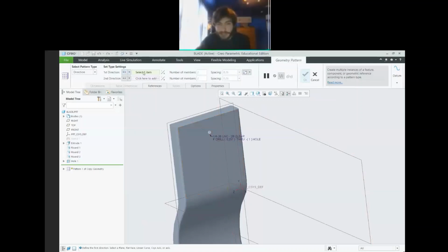So the first thing it wants us to do is to select our direction. And so we will select this, any sort of vertical line will do it, right? So I'll select that one. It wants to do it up. I don't want it to go up, so I flip it. We'll say, just for the sake of this, maybe I want 3. And the spacing between them, let's say, is going to be 2 inches. Maybe 1.5. Yeah.